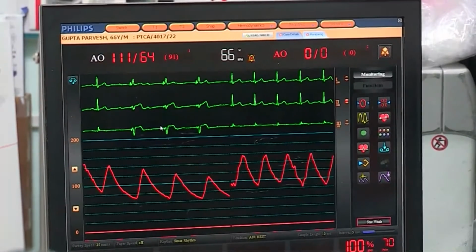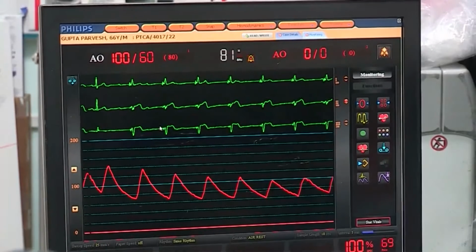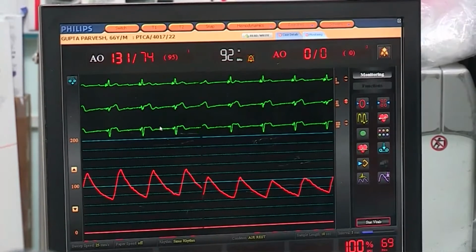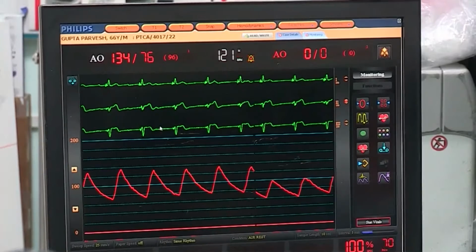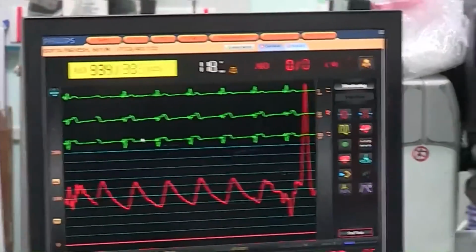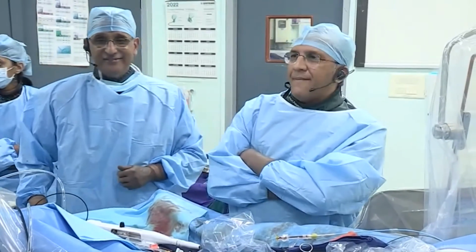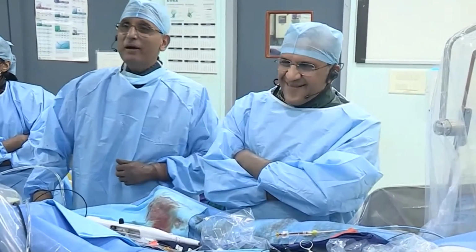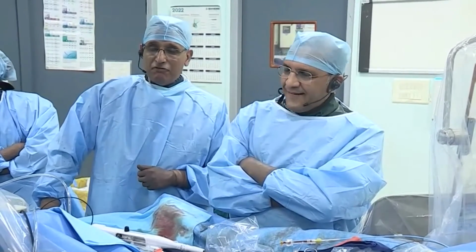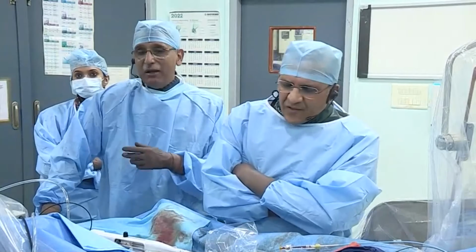So you see pacing there. I think it's a good demonstration because there are a lot of people who never use a pacer with Rota, or they claim they never use it. And then you ask them more aggressively and they say, I only use it when the patient gets asystolic, which means that you need to use it. There is this movement about right coronary artery rotas with aminophylline 250 milligrams. But in our experience, I think we are much safer with a pacer.